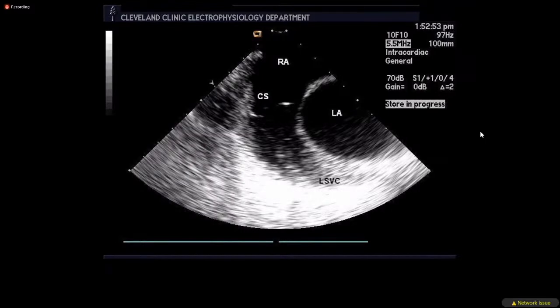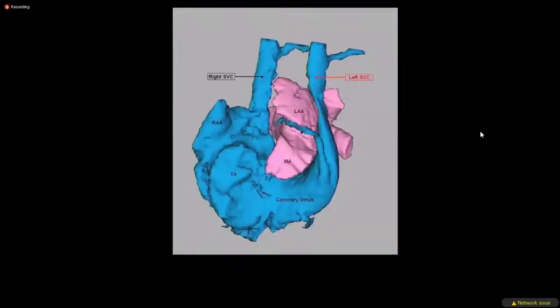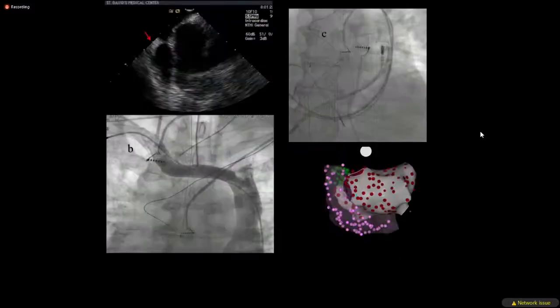And you see that the lasso is there. It's so big, and actually we put the lasso to target our ablation, because in these people, if you do not ablate the persistent superior vena cava, they will never be cured. They might have atrial tachycardia, more organized things, but here you see the bunch of lesions that we deliver to isolate the structure.